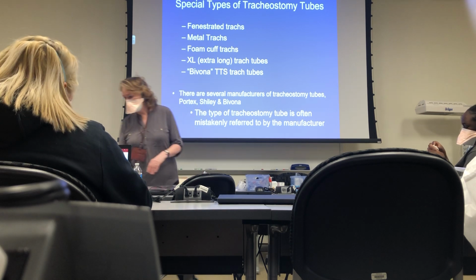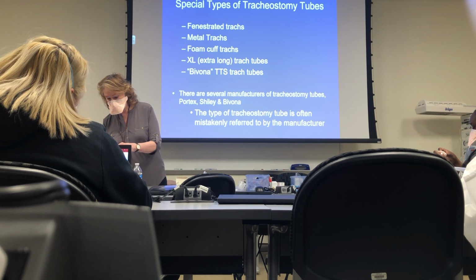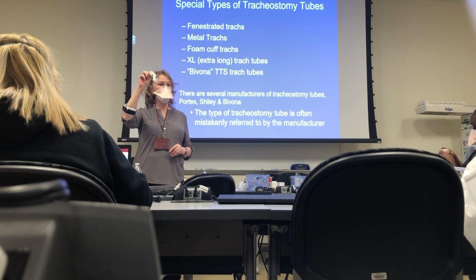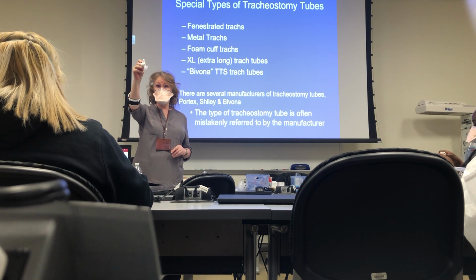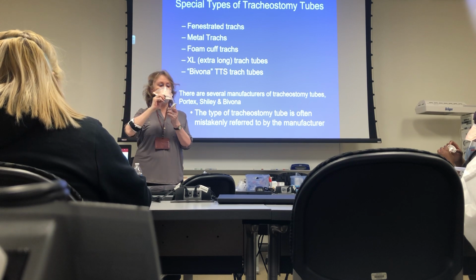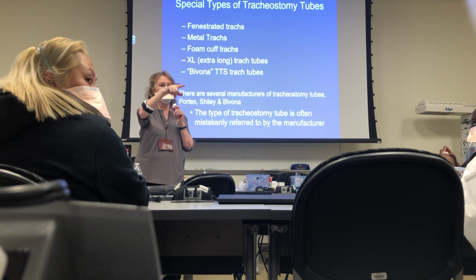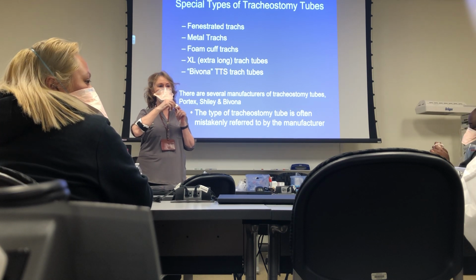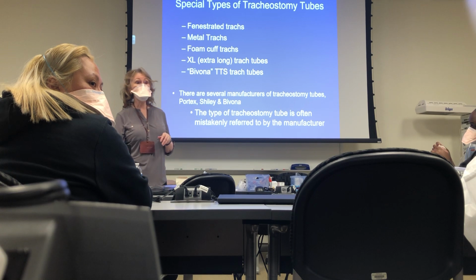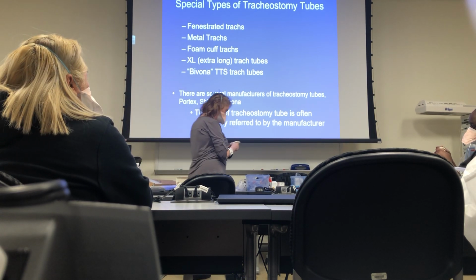Okay, let me see that fenestrated trach. Okay, yours has a hole in it. All right. Who has ones with holes? Does yours have holes? Yours has a hole on the inner cannula? Yeah. Okay. Both of them. Does yours have a hole on yours? Yeah, it does. Both of them or just the outside? It doesn't have the inside part. Your fenestrated trach doesn't have an inner cannula. Does your other one fit?